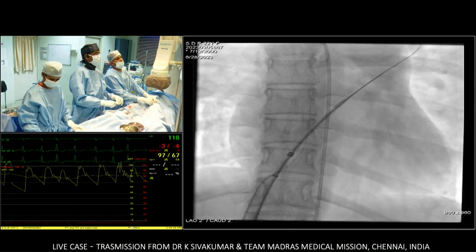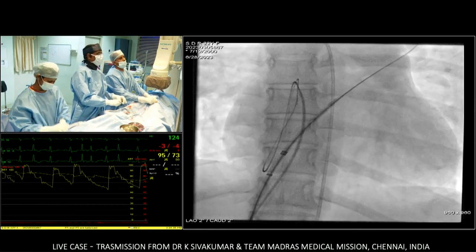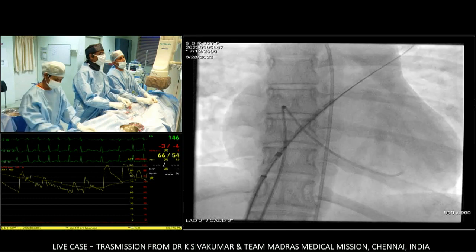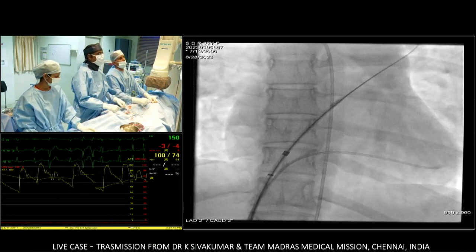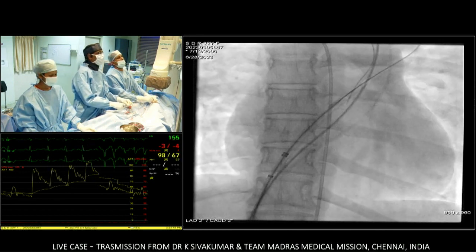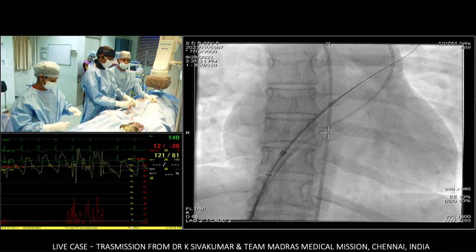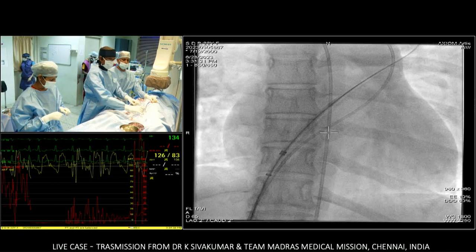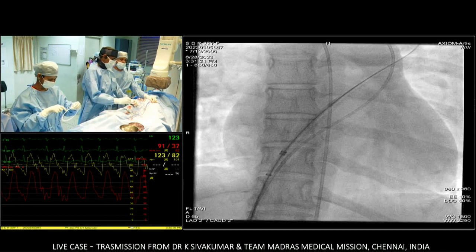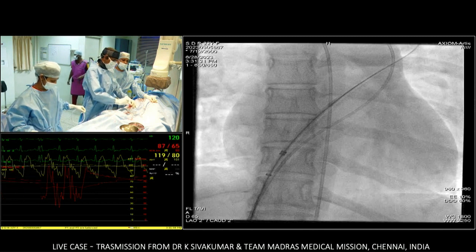The reason I ask is because I think that part of the pulmonary hypertension that's flow mediated doesn't reverse immediately. So I think you put the balloon up and you don't immediately see the pressure drop. You may want to wait a while and then you see a pressure drop. And I wonder whether there's an element of it that reverses gradually over, I can't tell you, but I think there is an element that may reverse over days and weeks. I think that her hemodynamics even before today would have been relatively favorable for a fenestrated device because it's a QPQS that's left to right predominantly.